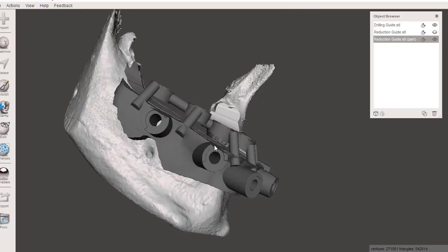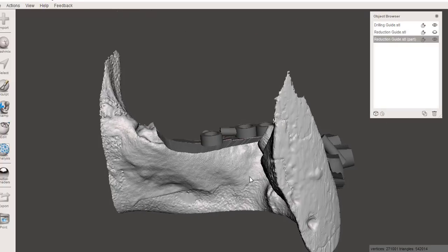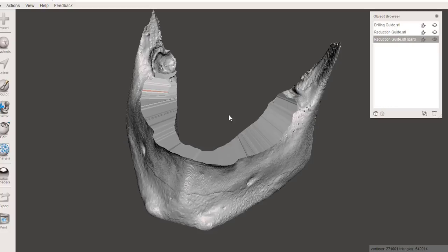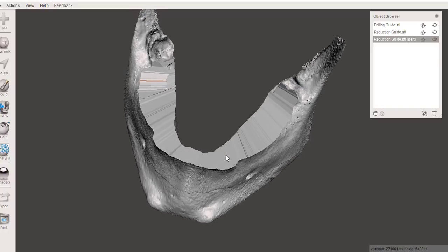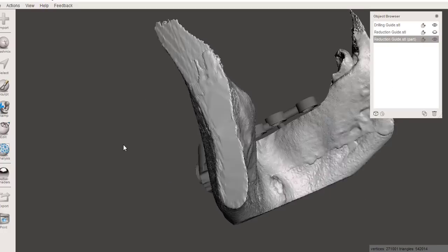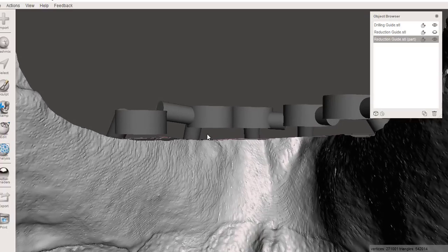And one additional nice thing is that historically when we did these, I would make a secondary conventional surgical guide just on this reduced jaw, right? I would just come back, turn my tubes on, and make a new guide on this. But the reason that I don't love that is because you had to be super precise with your bone reduction. And if you left even a spicule of bone high, your secondary drilling guide would not fit well. In this case, you don't have to worry about that because there's a gap between these tubes.